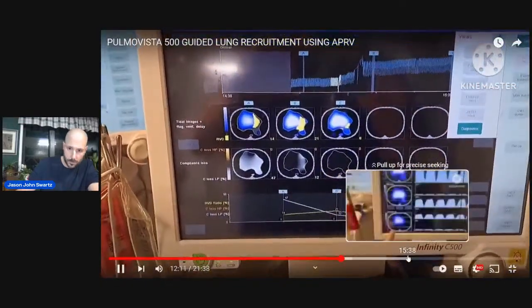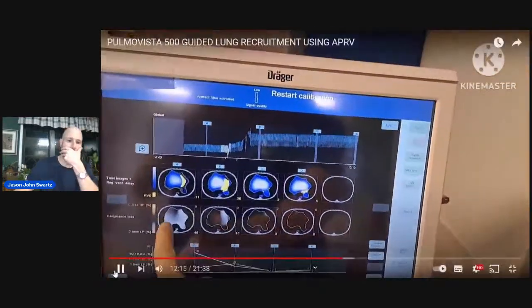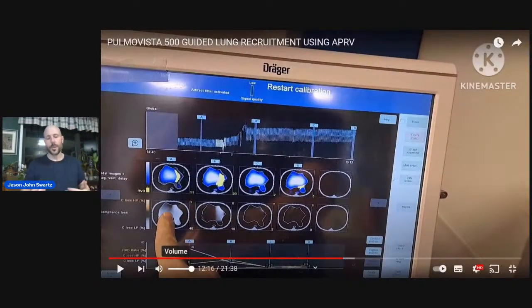Diagnostics. Okay, again over here, this was the issue. And so that's what you're basically doing constantly. Okay, go back to views, go back to diagnostics. It's been another 5-10 minutes. Click, put up my time points where my times are, and then analyze, just to keep on trending, keep on making sure. Okay, anything changed, and again we're comparing A and B.